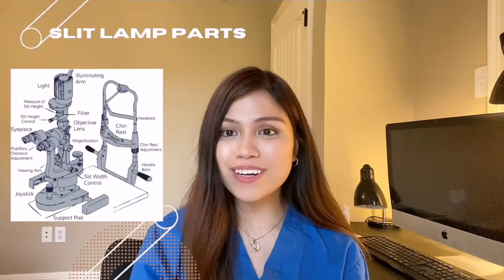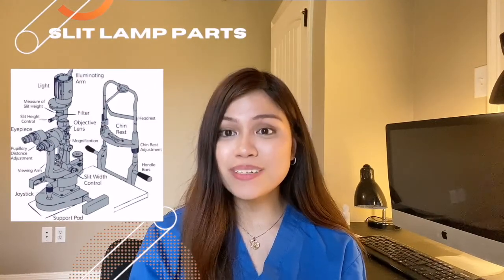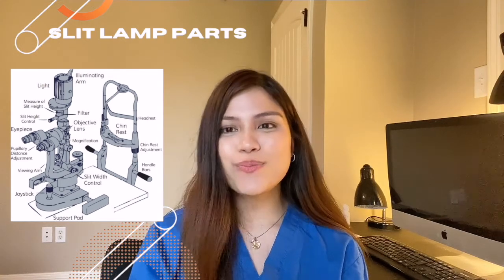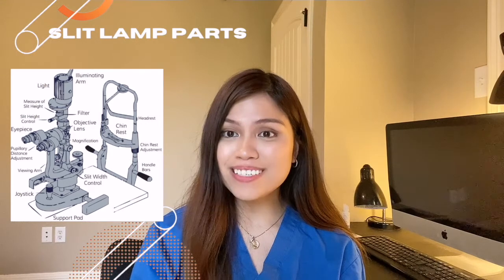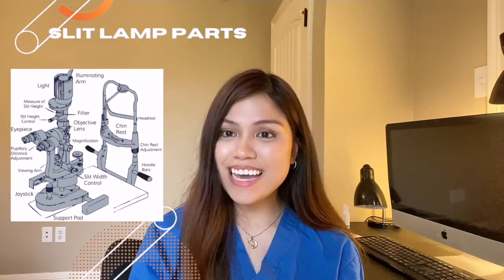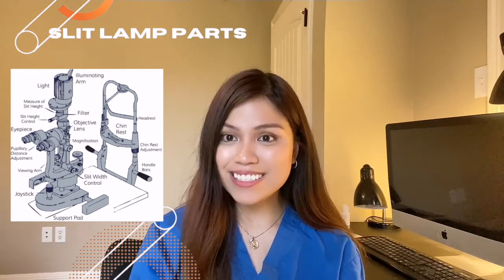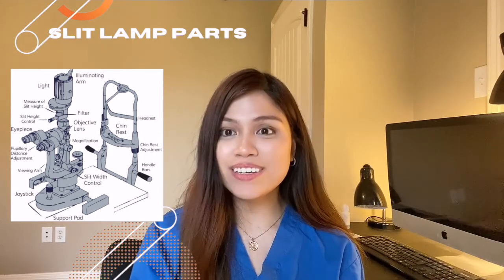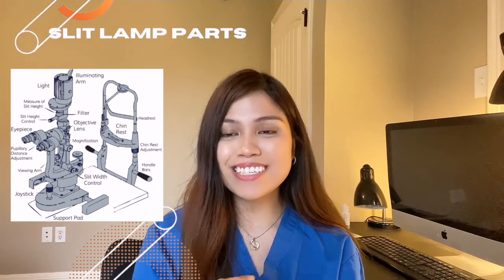The last part of the exam is a slit lamp examination. A slit lamp has various parts. It has a headrest, a chin rest adjustment, handlebars, support pad, joystick, viewing arm, eyepiece, magnification, objective lenses, light, illuminating arm, a measure of the slit height, a slit height control, slit width control, and the pupillary distance adjustment.